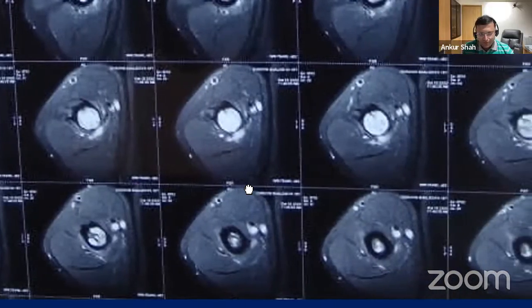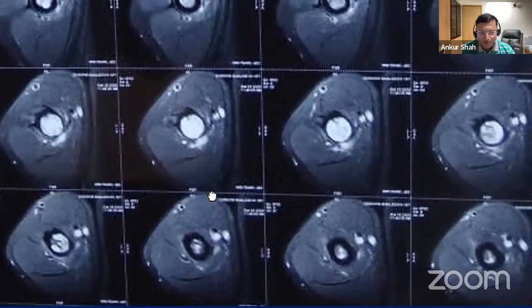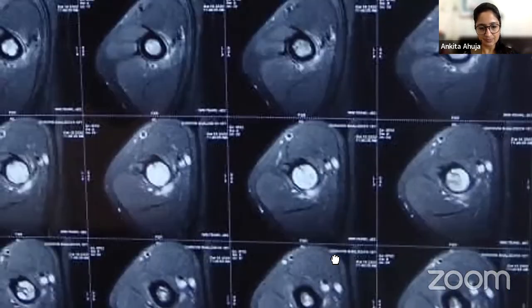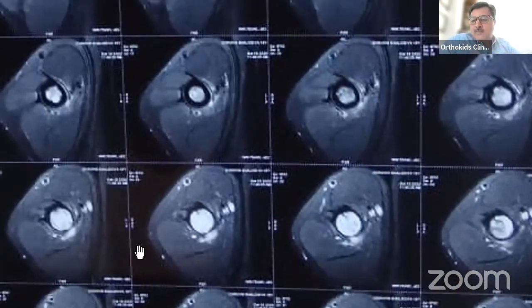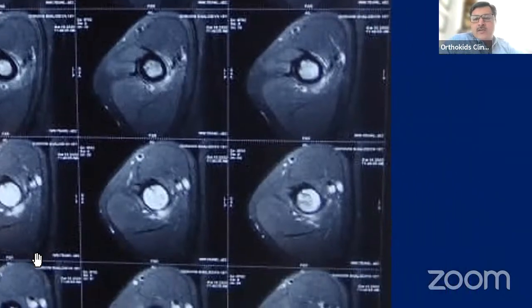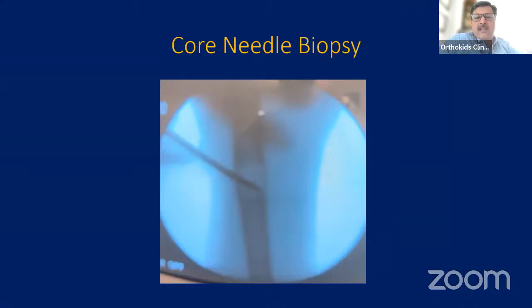There is soft tissue edema as well, again, which could be because of the fracture. So in a nutshell, we were all confused, as this is not a typical thing. The next step was to involve Mandip and to take a biopsy. Joyance, can you move ahead with what we did? Mandip, any other thing you want to add?